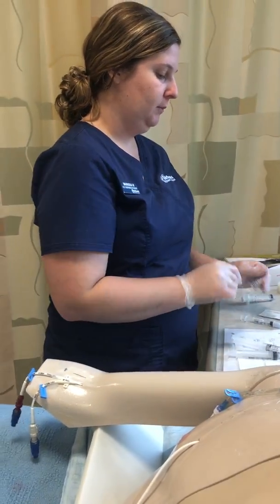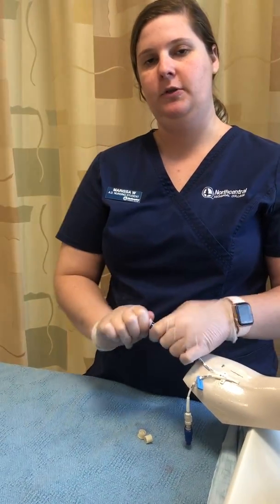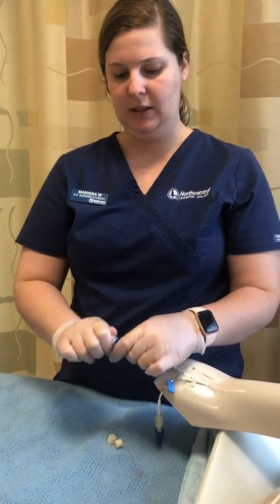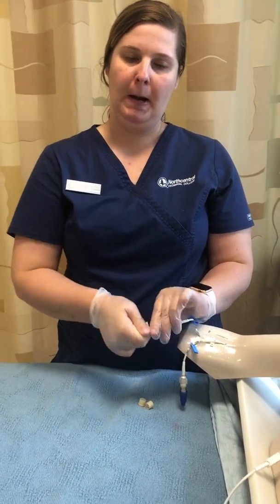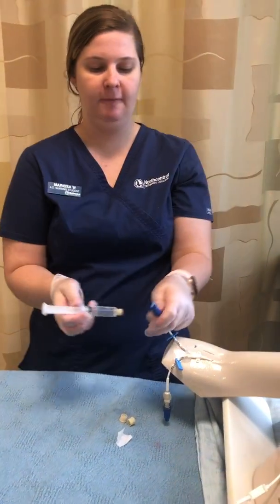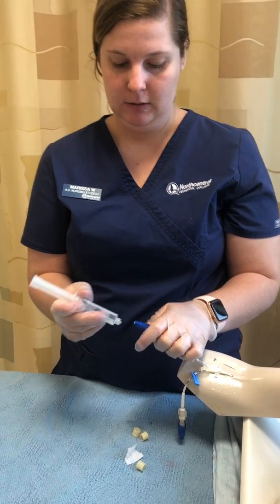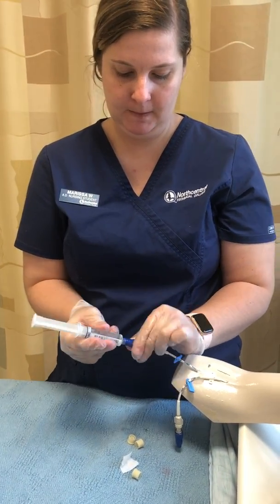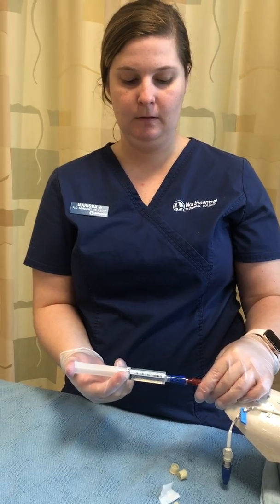And then I'm going to be doing my last flush. So when I'm doing my last flush, I'm going to be doing the first 30 seconds of my flush at the same rate of the medication that I just administered. And then for the rest of it, since it is on a PICC line, I need to be giving the flush in a pulsating flushing motion. So again, connect, unclamp, and the first 30 seconds I'm going to be doing it at the same rate.